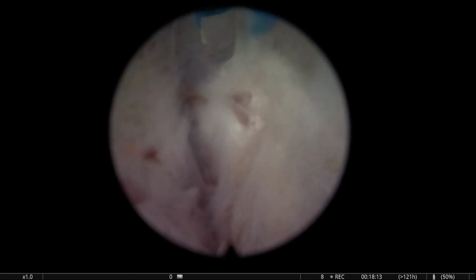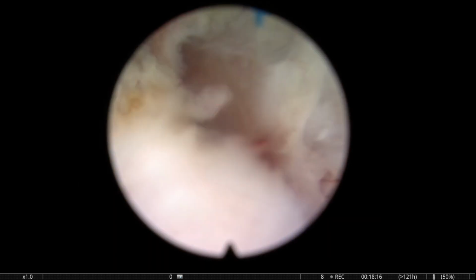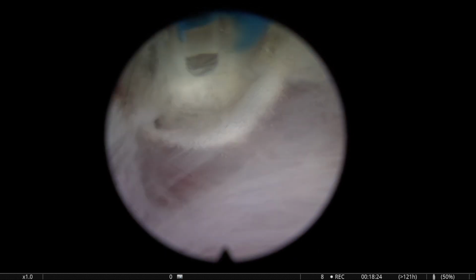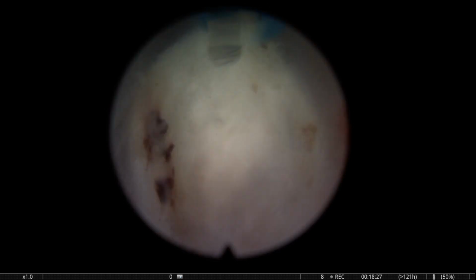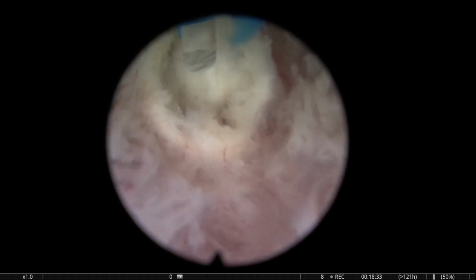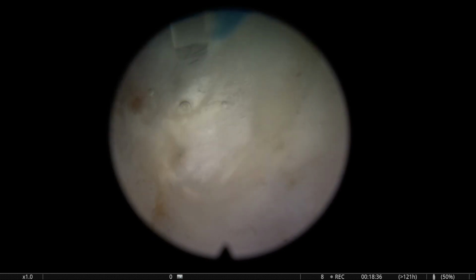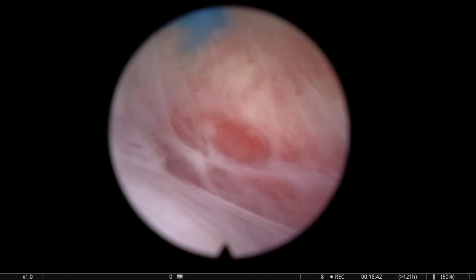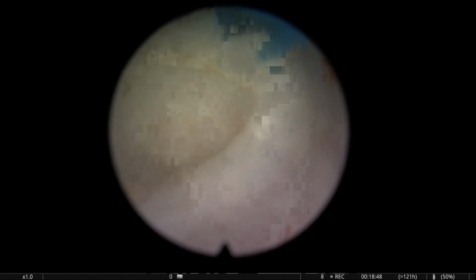you know, because of course when you have a very beautiful plane and you can recognize it very nicely, it's nice to be there. It's nice to follow the perfect anatomical plane. But here we had a hint that we were in a very nice depth for a moment. Here also you see that's probably the good anatomical plane, and the line we are following is coherent with this depth. So probably we are okay, and there we are progressing around until we can start seeing the sign that we are going to enter the bladder neck.